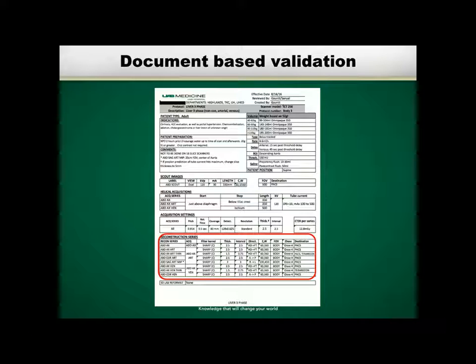It has a list of all the reconstruction series that are on this scanner, with a fair amount of detail for each. One of the bits of detail is, for each one of these recon series, which acquisition it was generated from. This sounds obvious, but when I started getting involved in this, we had these standard protocol documents, but they didn't even list how many different acquisitions there were. Why? Well, the technologist knows that this is a one-phase or a two-phase or a three-phase. We're not documenting it if it's still in the brain of the technologist. You want that information here.